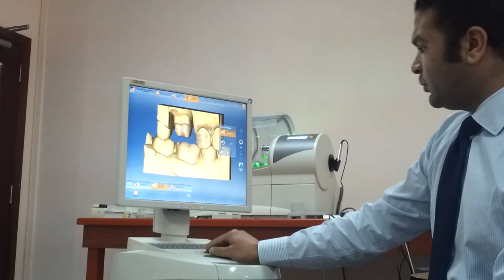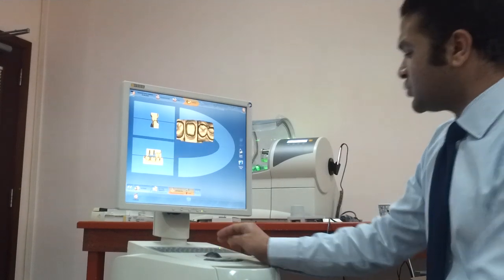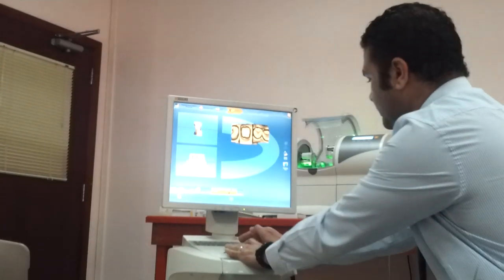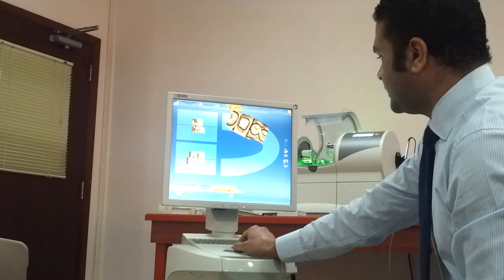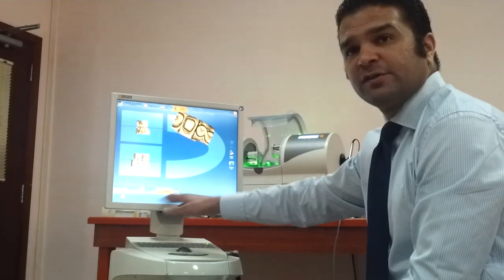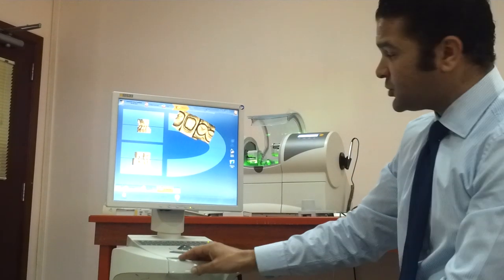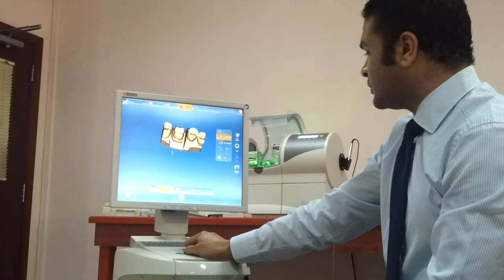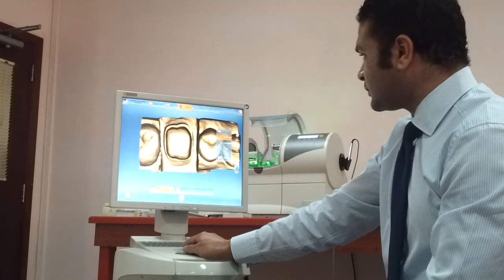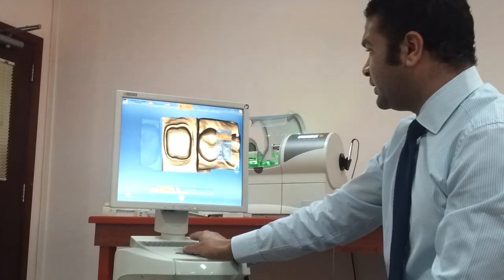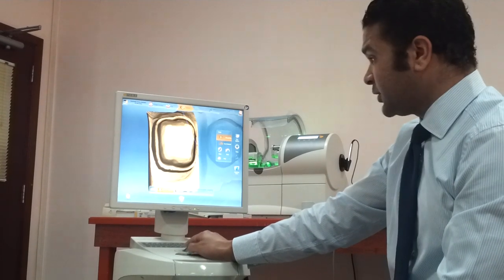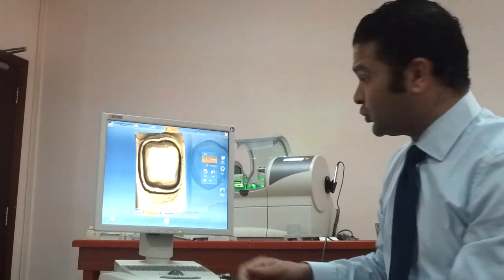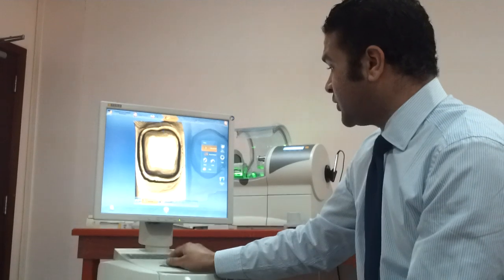Now I'll set my occlusal relation. The software asks me to set my model axis in the normal plane — simply press OK and follow the lines. I'll trim as if doing ditching for my dies to properly check my finish line from the sides and proximal contacts. This is similar to what you do with a normal removable die — ditching to check margins and proximal contacts.